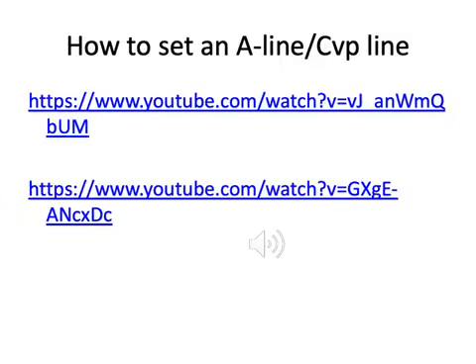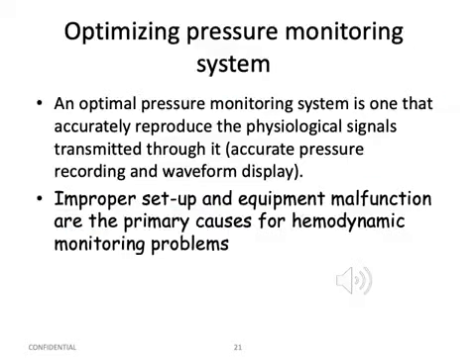هلا for more understanding على الميكانيزم أو how to apply arterial line CVP line والzeroing والleveling اللي أخذتوه بالعملي، طبعا في عنا هون two very simple videos that you can watch, will help you a lot إنه understand كيف إحنا ممكن نعمل zeroing leveling، كيف بصير insertion للarterial line والCVP line والmonitoring. هلا usually we use an invasive monitoring system للهيمودايناميك حتى to gain more accurate reading.